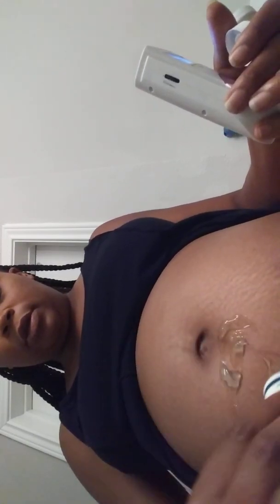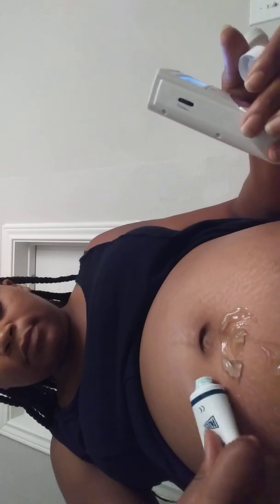All you have to do is put some gel. You usually want to look for the heartbeat fairly low, like around the mid area. So I'm going to put my gel there. The gel goes really fast so you don't want to use too much.